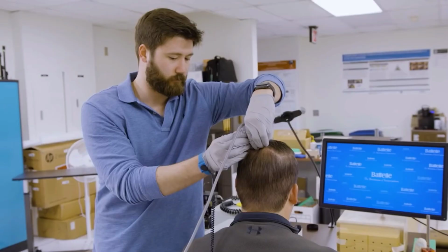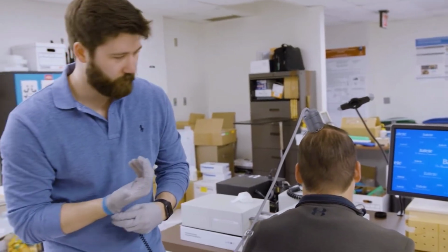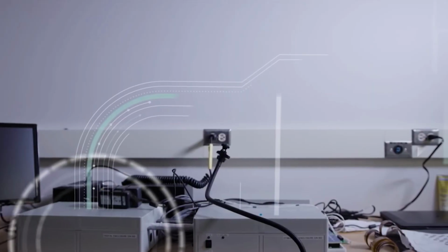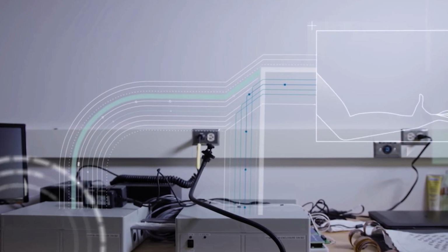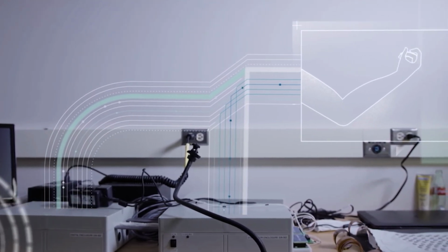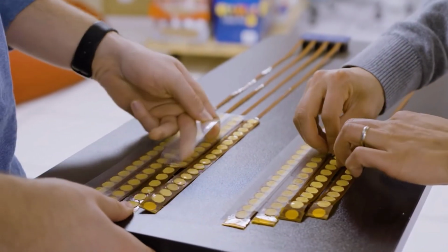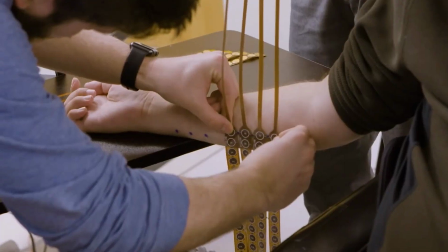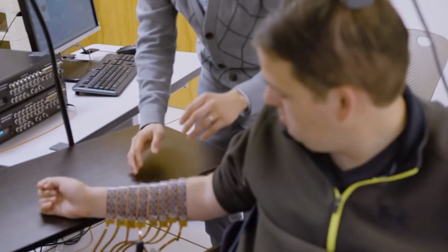charge of voluntary movement. With a small chip implanted into his brain and through the computer that is connected to him, he was able to acquire basic movements through repeated thought training. The device is somewhat like AI, it's just that it's still Ian's brain conducting the training. For instance, whenever Ian wants to open his hands, neurons in his head release the instruction, but because of spinal damage, the signals cannot travel to his hands, which will do the movement. This is where the magic of the chip takes place.